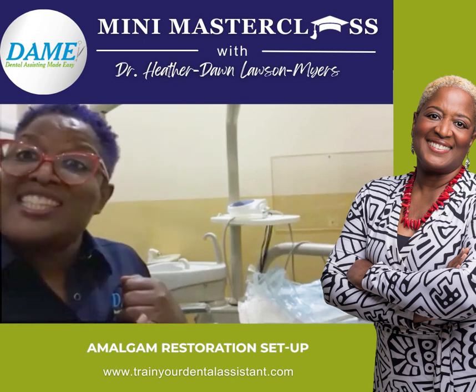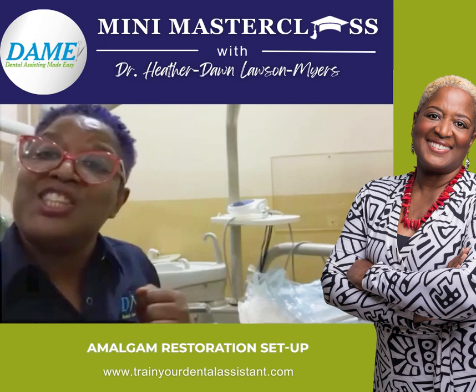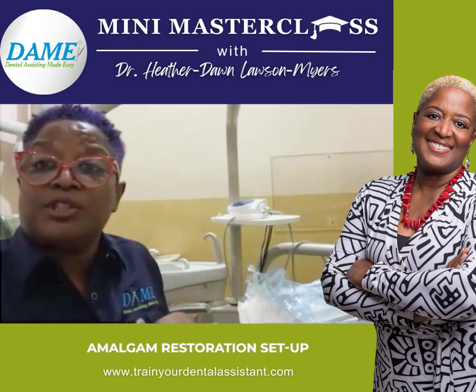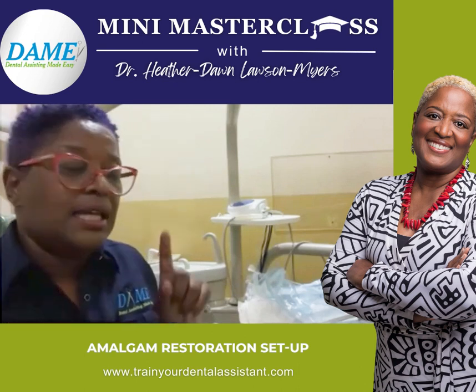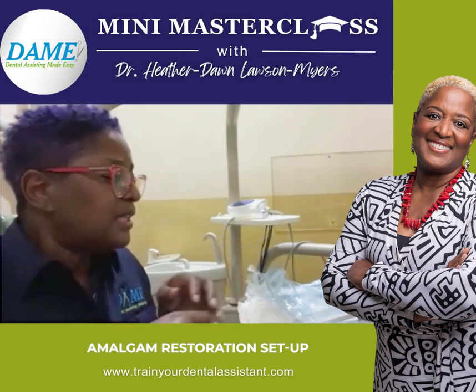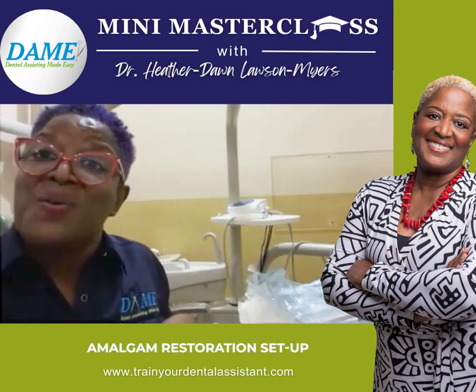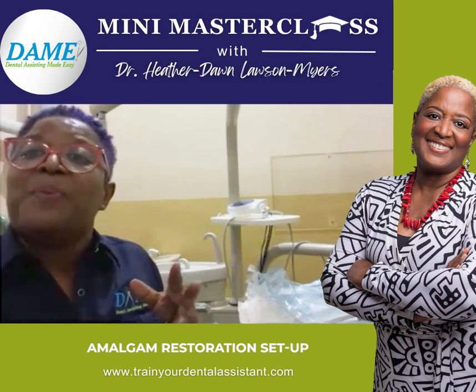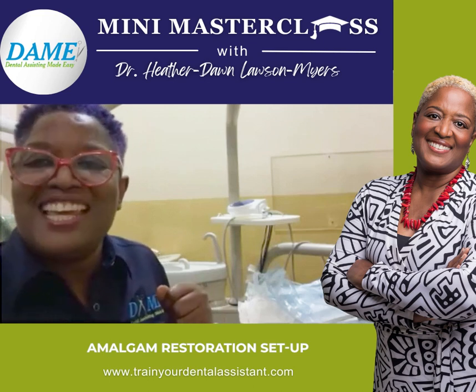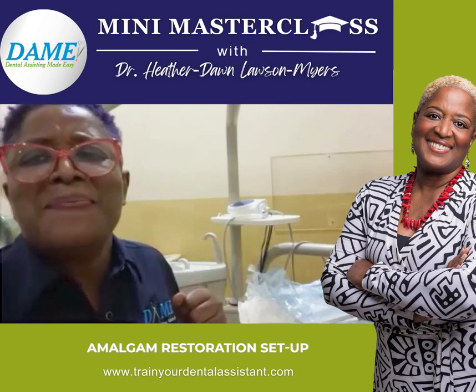But you knew the sealant, which is a preventive application on teeth to prevent tooth decay. And then we spoke about two types of filling materials, the composite resin and the amalgam. The amalgam is a silver filling and it's packed in and it is left to harden, whereas the composite is hardened by a curing light. Okay, that is all I have for you today. You are a dental assistant in the making.